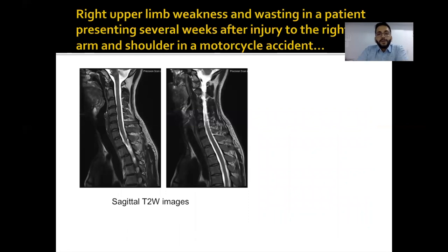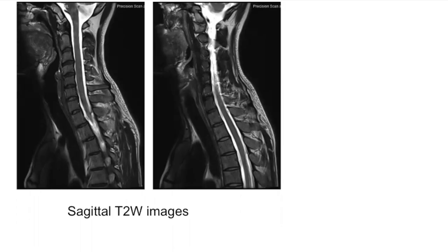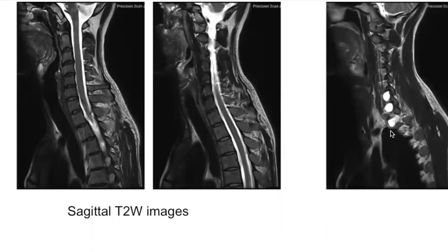Here is an interesting case — a patient who sustained injury in a vehicle accident with injury to the right arm and shoulder, presenting several weeks later with right upper limb weakness and wasting. When imaging patients with suspected brachial plexus injury, the first sequence should always be a sagittal T2 sequence of the cervical spine. The cervical cord here looks perfectly fine with no evidence of contusion, edema, or hemorrhage. But slightly far laterally on the right side, we can see well-defined cystic lesions in the neural foramina at C6-7, C7-D1, and D1-2.